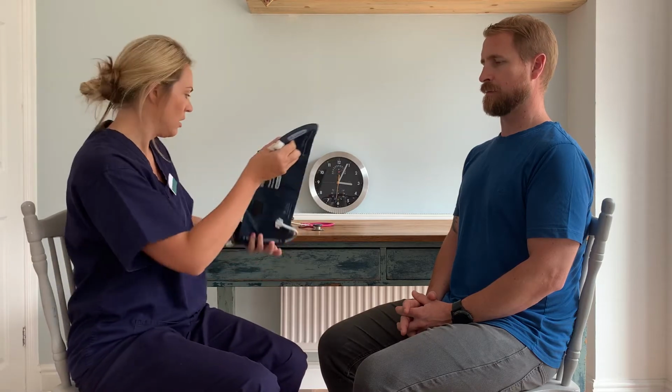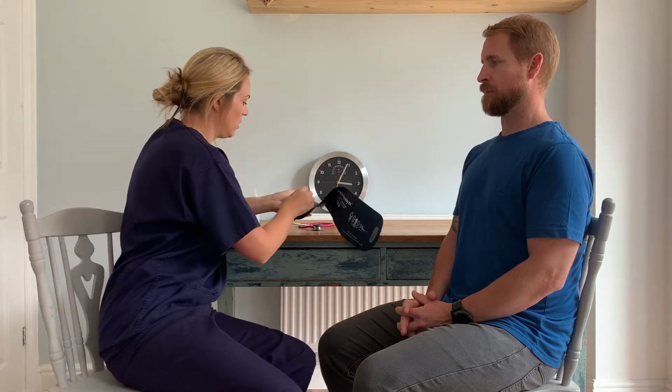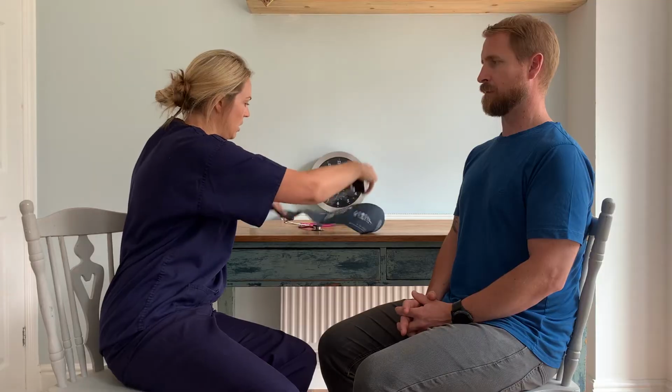So for those of you who have limited experience in taking blood pressures, this is the equipment that you will want to either purchase or have access to for practicing. So you need a stethoscope and a manual sphygmomanometer. So I'm just going to lay this one out so I can clean the cuff.